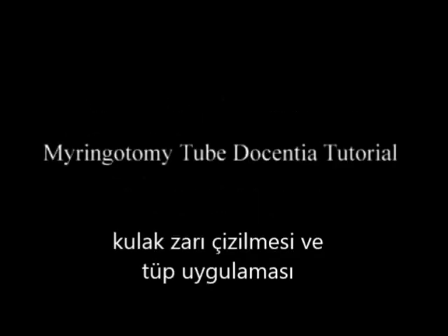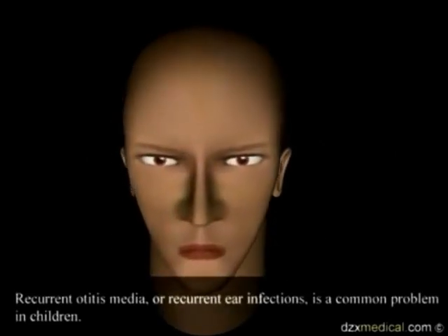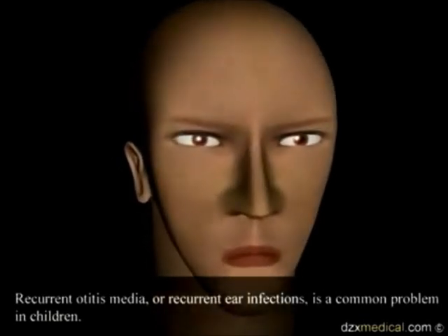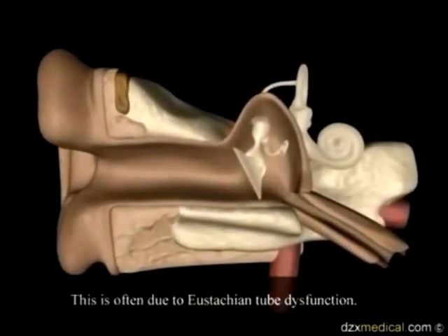Myringotomy tube insertion tutorial. Recurrent otitis media, or recurrent ear infection, is a common problem in children. This is often due to eustachian tube dysfunction.